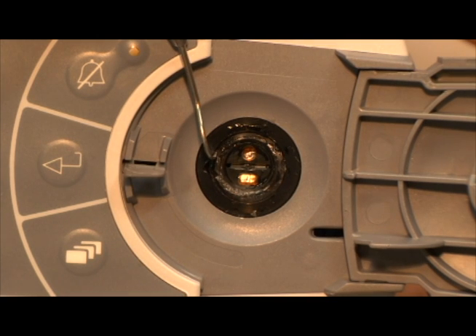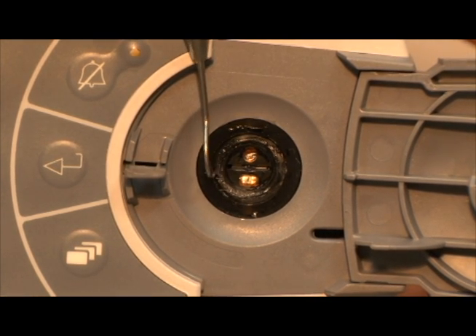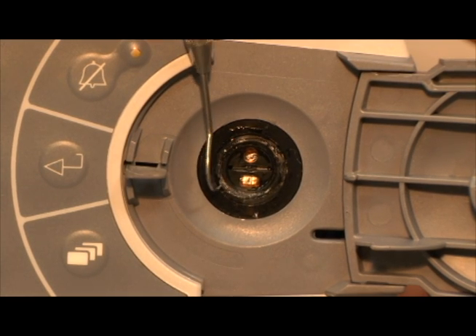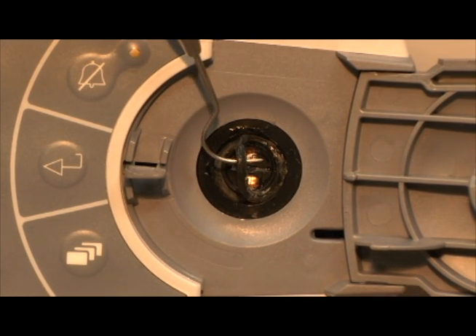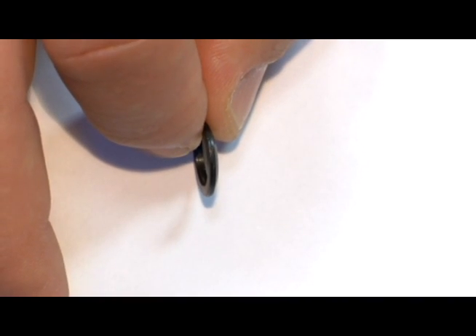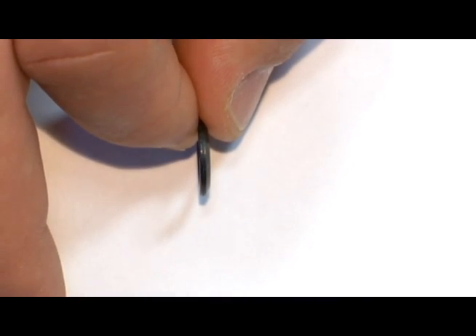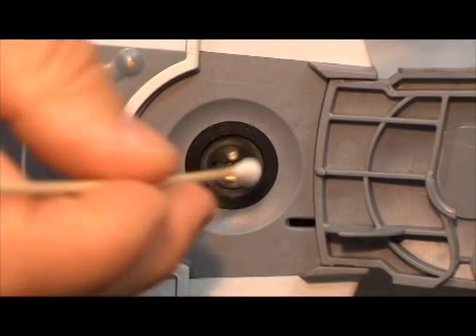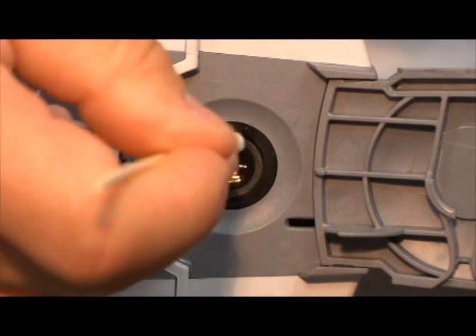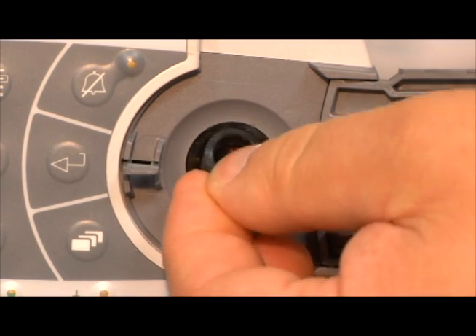To remove the gasket, use an O-ring pick or tweezers and carefully get under the gasket without scratching the docking surface, then lift the gasket out. Note the gasket has a flat side and a beveled side. When replacing, the flat side goes in and the beveled side faces out. For ease of replacement, wipe the gasket gland with alcohol, then push the gasket in place with a cotton swab or blunt end of an O-ring pick.